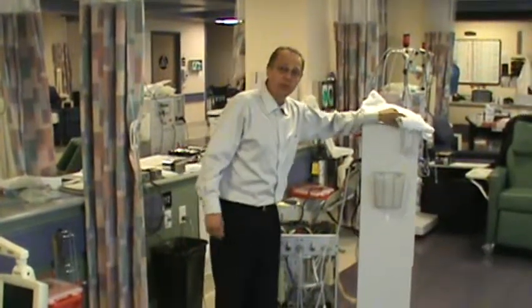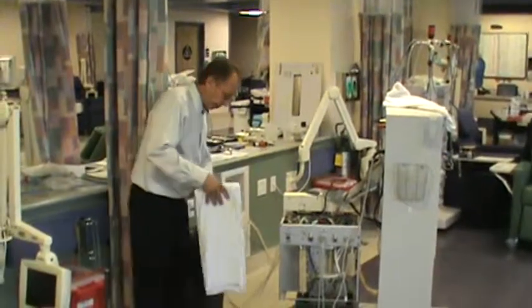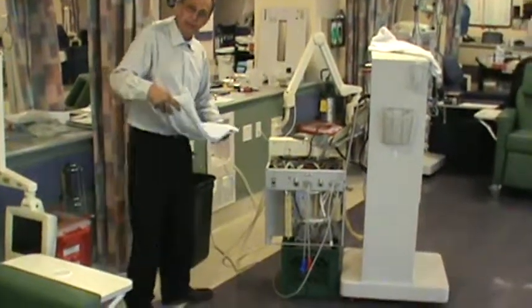This is part four of the annual PM on the Fresenius 2008K machine. The first thing I'm going to do is rebuild the bicarb and the acid panels.